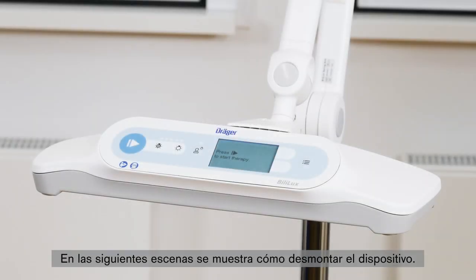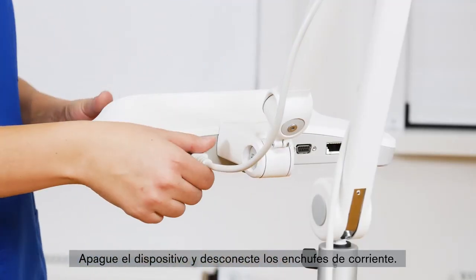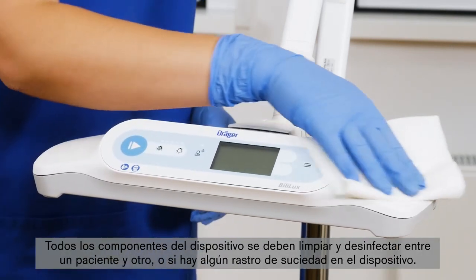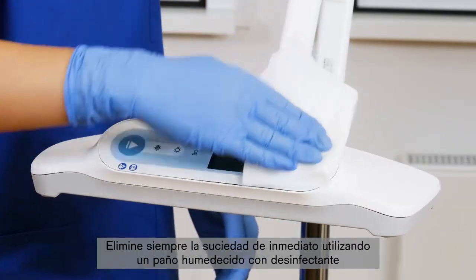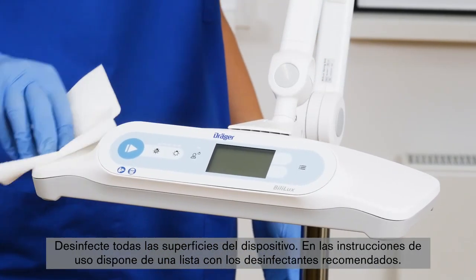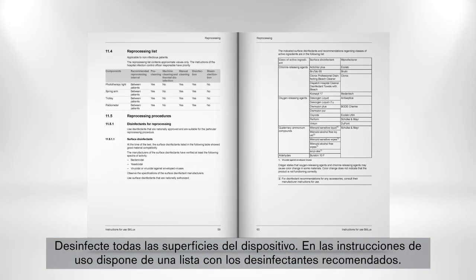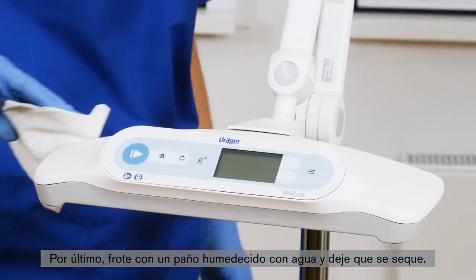In the following scenes, we will show you how to disassemble the device. Switch off the device and then disconnect the power plugs. Allow the phototherapy light to cool down before beginning reprocessing procedures. All parts of the device have to be cleaned and disinfected between every patient, or if the device has any soiling. Always remove soiling immediately by using a cloth dampened with disinfectant. Perform surface disinfection of all device surfaces. Consult the IFU for a list of recommended surface disinfectants. Finally, wipe with a cloth dampened with water and let the device dry.